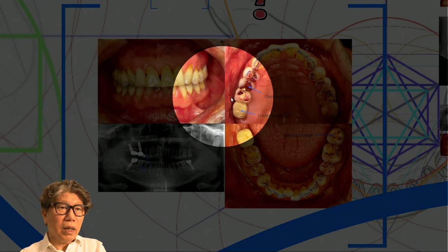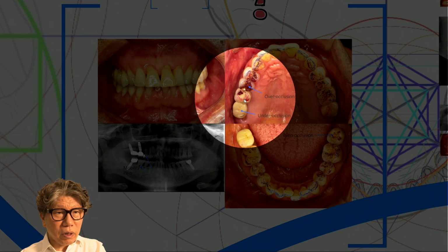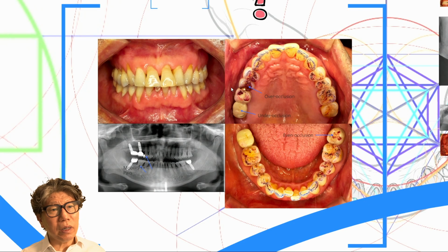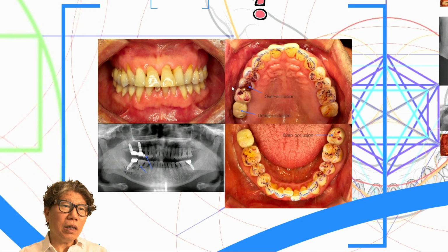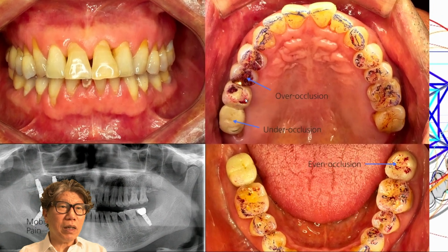on the right side, it's the first molar, and occlusal adjustment was performed. It seems like it was done by a doctor with slightly less prosthetic skill. During the occlusal adjustment, they carved out this area. They just carved it out deeply. It was just carved deeply, nothing else.